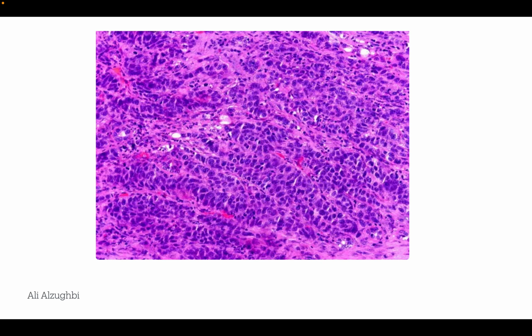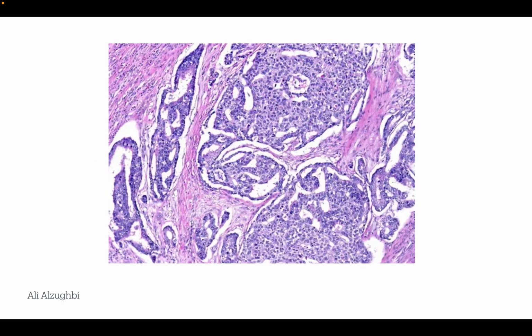hyperchromasia, and nuclei. Here also, this is definitely high-grade. Maybe the lighting is very powerful, but if we go high power, there are high-grade features of the cells. That's it, and thank you very much.